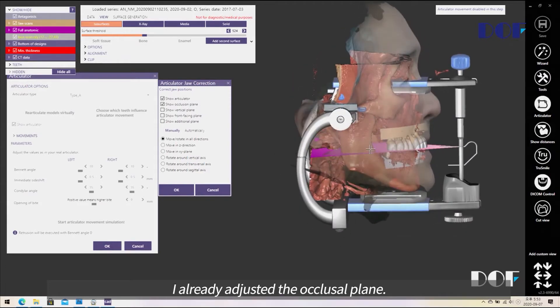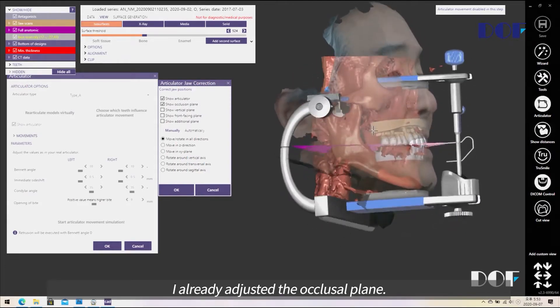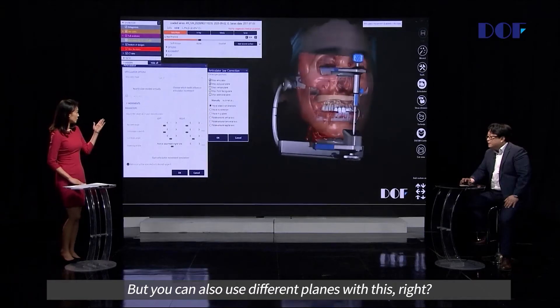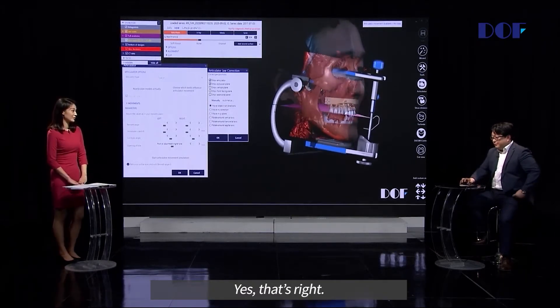The occlusal plane is already adjusted, but you can also use different planes with this as well.